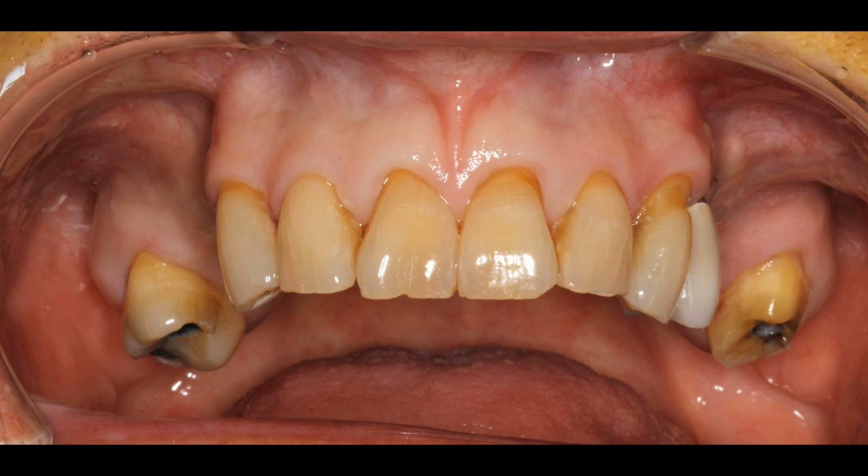His back teeth were so good, and I decided, I should say, I encouraged him or recommended that we keep those 2 back teeth, which is a pretty lengthy discussion about proprioception. If you can leave a tooth or 2 in one arch where you can feel how hard you're biting, that does help some patients with forceful bites know how hard they're chewing, because implants don't really give you the same feedback as natural teeth.